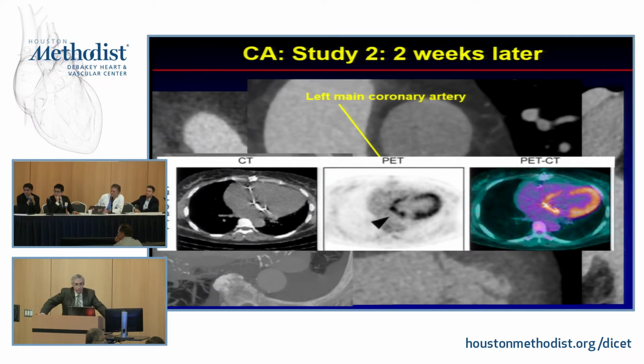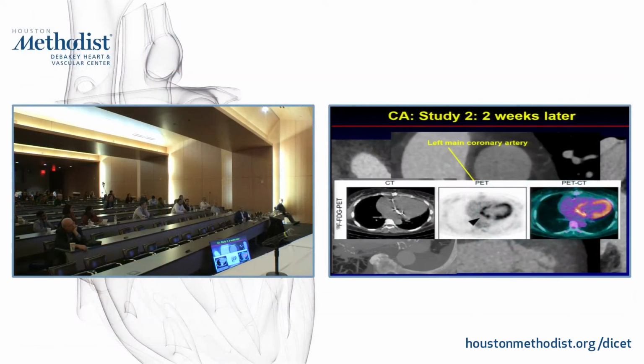These are the ones that give you a little nightmare. Yeah, absolutely. You have a graft, a composite graft at times in the ascending aorta, and you see a little space. We've described them from the early days of Stanley Crawford, where he did a lot of them here. And you have this little space, and is this infected, yes or no? Gradually it goes away with time, but I don't know what the time course of that is.